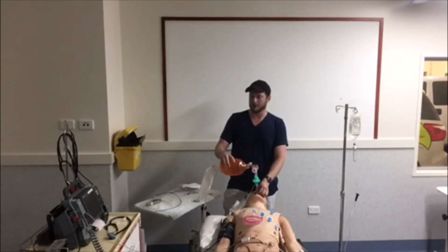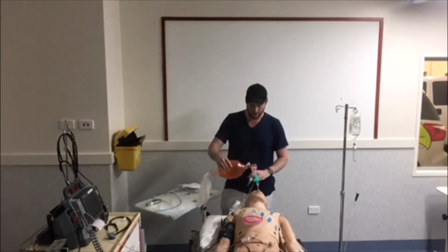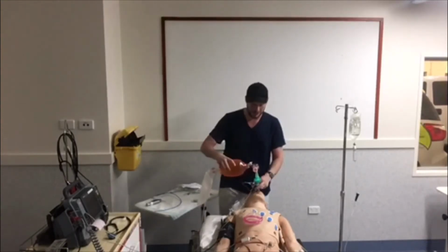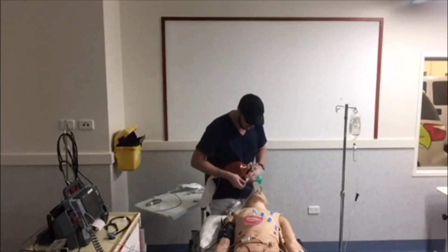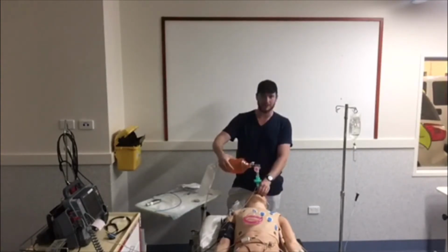So I'll give it a few breaths just to make sure that end-tidal is really, really good. And funnily enough, it's a really good seal. I haven't even inflated any air in yet. I'll inflate some air now, 10 mils, and I can confirm how much after. So it's really hard without an airway assistant. Cool. Done. And that's in there.